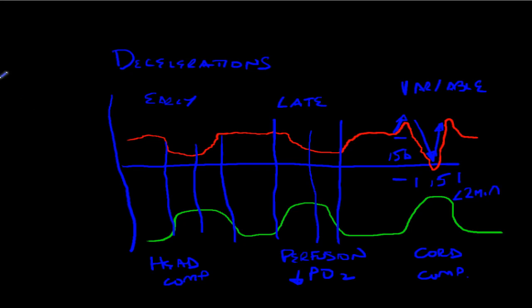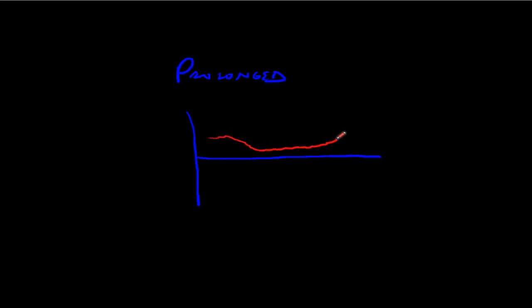One last deceleration is a prolonged. And this is very simply any deceleration that lasts greater than 2 minutes, but less than 10.